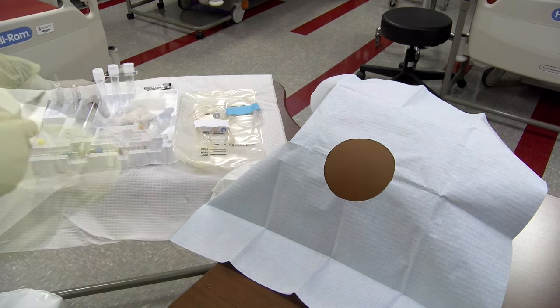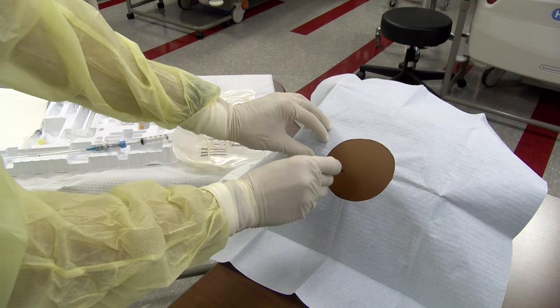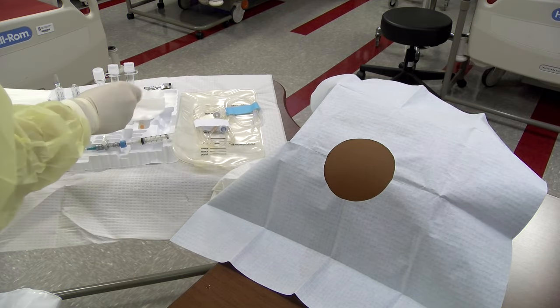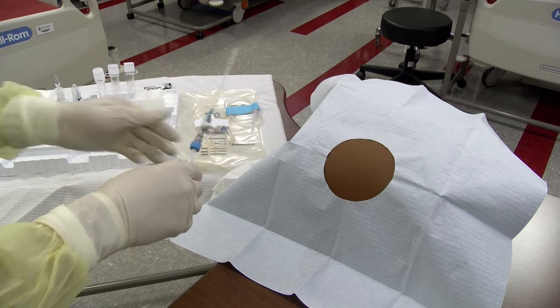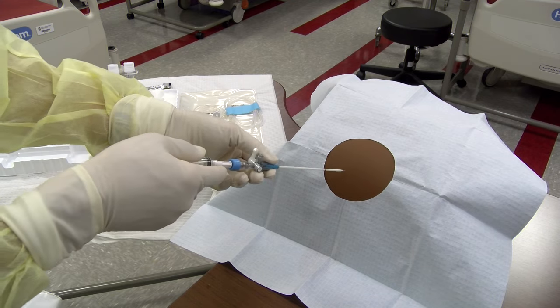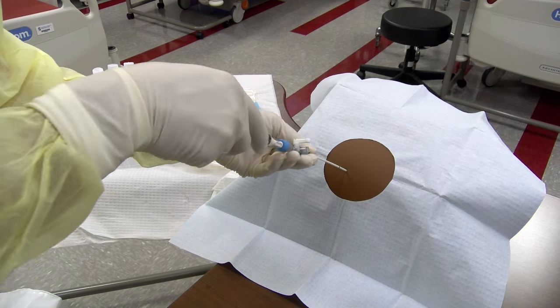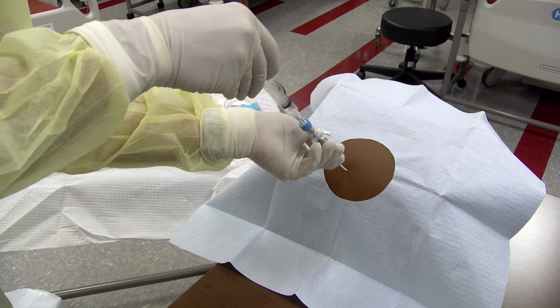Set up the collection tubes and catheter system while the anesthetic takes effect. Make a stab incision using an 11-blade scalpel at the center of the wheal site. With a syringe in place on the catheter over needle device, pull traction as the needle punctures the skin and advance the needle through the stab incision. Continue advancing until ascites fluid is returned. Advance 5 millimeters further to ensure the catheter and not just the needle tip are within the peritoneal cavity.